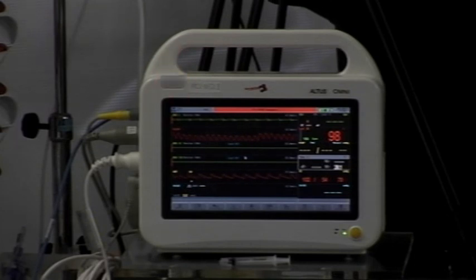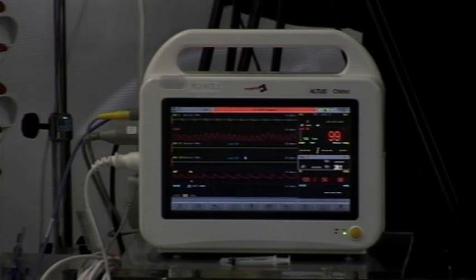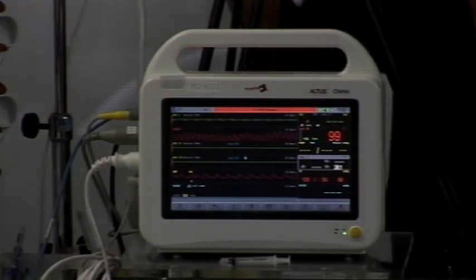It's not that I want to convince you. I don't care if you use HFOV or conventional ventilation. It's just that if you use HFOV, use it properly. That's the only thing I like. Being careful, stepwise, pay attention, spend time bedside, have good monitoring system, train your nurse, it's a teamwork, and it will be very easy. And you see, only 2 buttons. This one and this one.